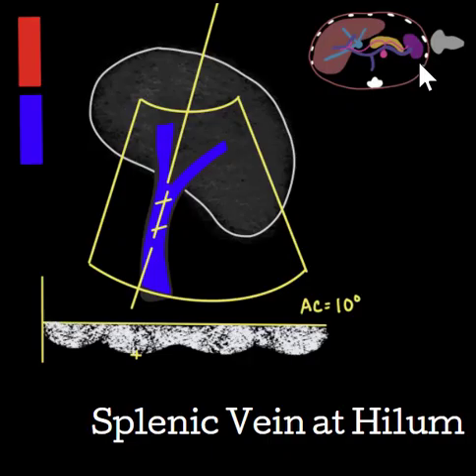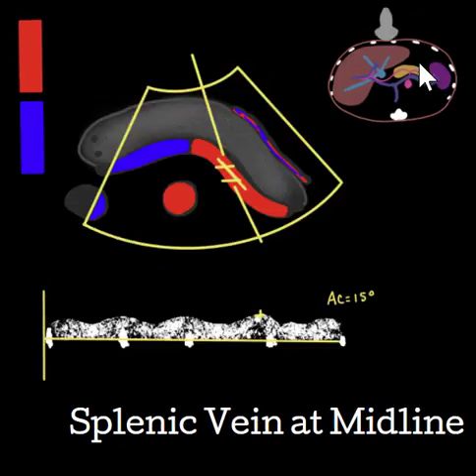Start the splenic vein at the hilum. Use the left intercostal window to show a blue vessel exiting the spleen. Pulsed wave Doppler should show steady flow if the patient is holding their breath, or phasic flow if the patient is breathing, all beneath the baseline. With angle correction on and less than 60 degrees, measure the fastest velocity recorded. Evaluate for patency and flow direction as well.